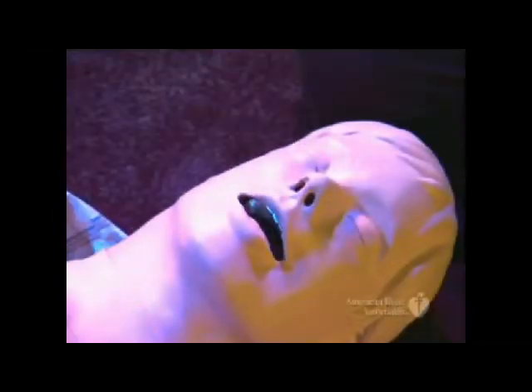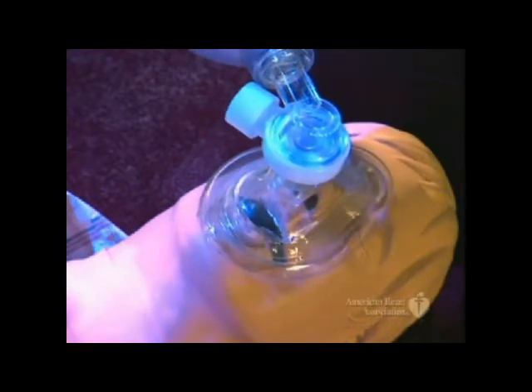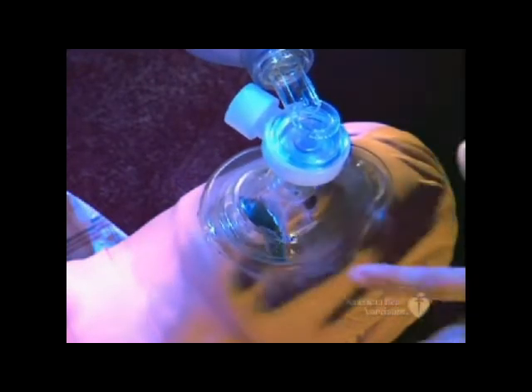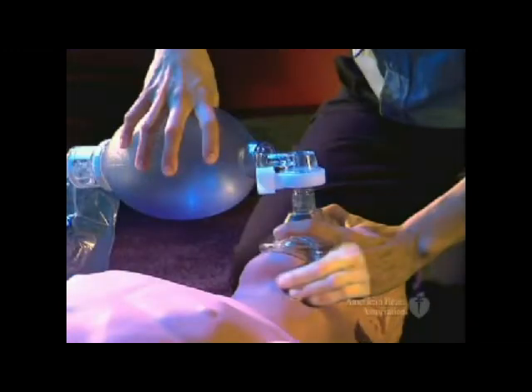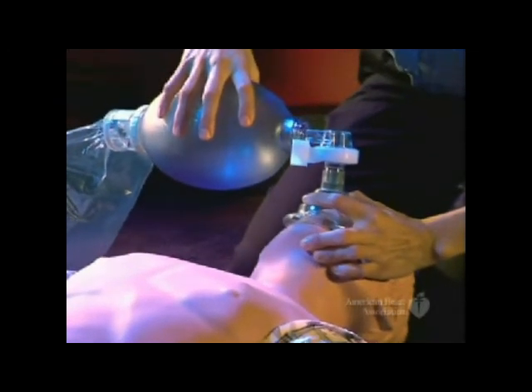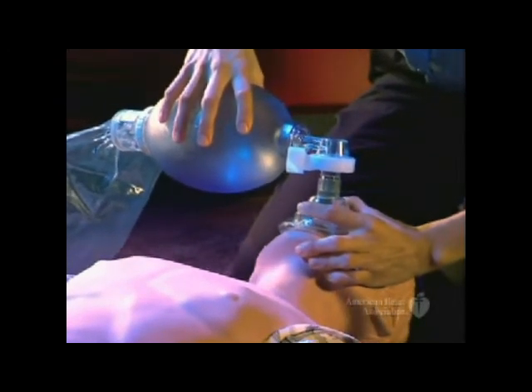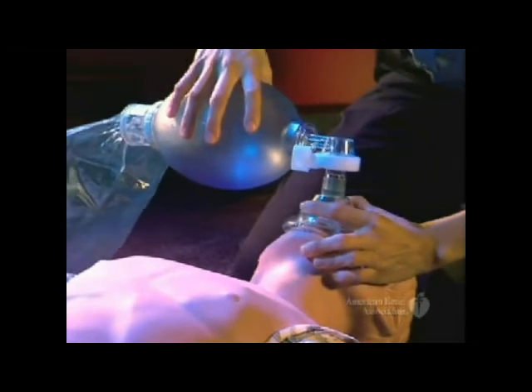First, position yourself directly above the victim's head. Place the mask on the victim's face using the bridge of the nose as a guide. Use the thumb and index finger of one hand to make a C to press around the edges of the mask. The remaining fingers of your hand should form an E to lift the angle of the jaw and open the airway. Make sure you squeeze the mask with your thumb and the heel of your hands while lifting the jaw to achieve an airtight seal.